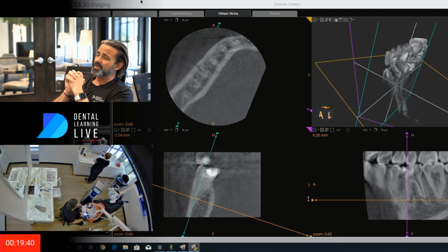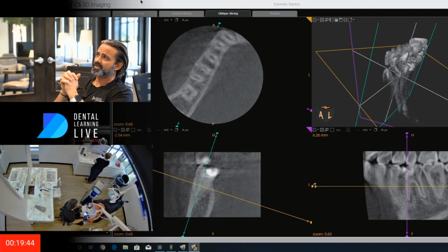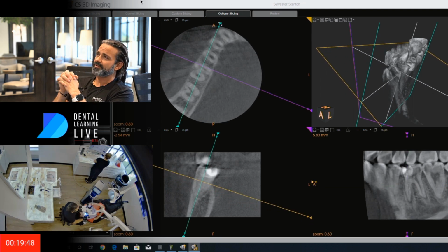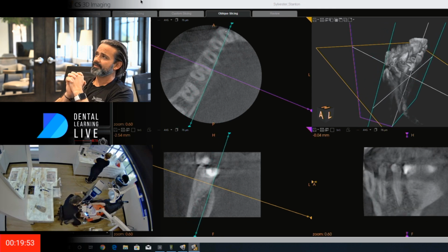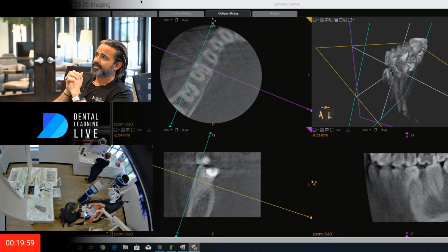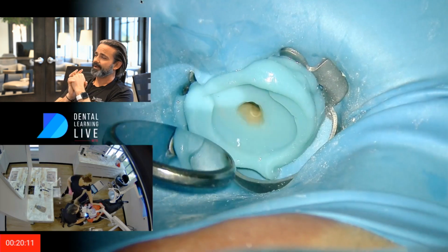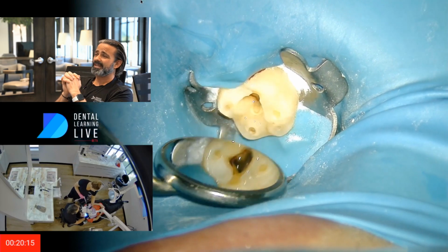And you can see the abscesses as we go down. Those terminuses are in bone marrow space. Cortical plate covering the prominence, the eminence of the root. Abscess formation there. And there's your cross-sectional anatomy of this tooth. All right, so now that I'm done, we're going to take this off.